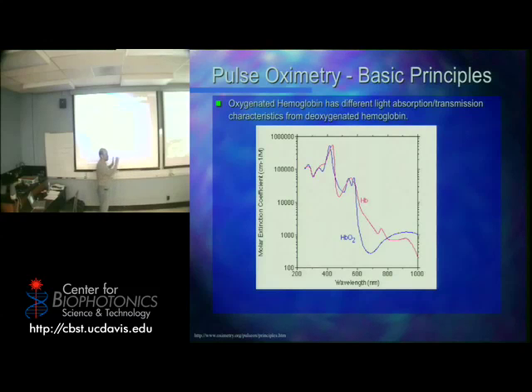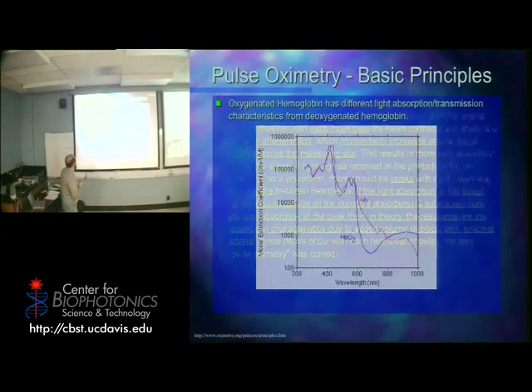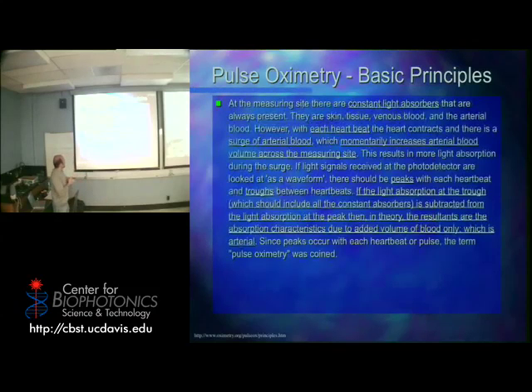And what interesting thing happens between those two regions? Do you see anything interesting happening between this region and this region? It switches, they cross. And that's a key point that we take advantage of when we use this instrumentation. So, some basic principles to think about.